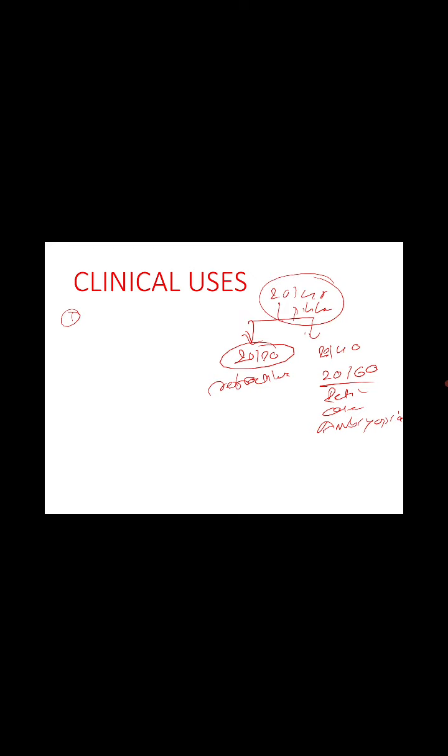But second, there is also a second use of pinhole that many fewer people know, to differentiate monocular diplopia. See, binocular diplopia, we cover one eye and the diplopia goes. This is binocular diplopia. But if monocular diplopia is present, then we put a pinhole and see if the monocular diplopia persists, then it may be cortical diplopia, which lies away from the retina, in the visual cortex.